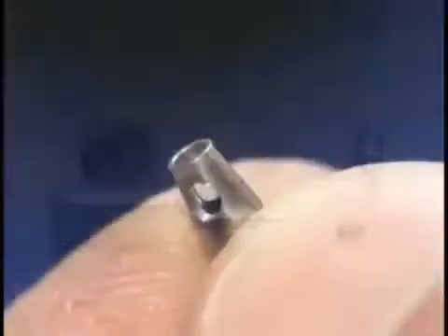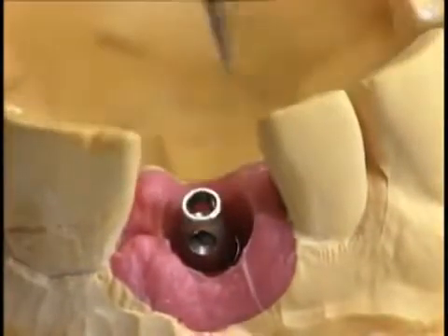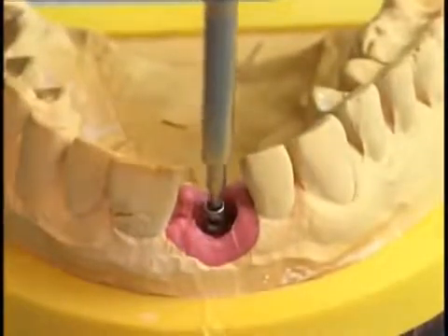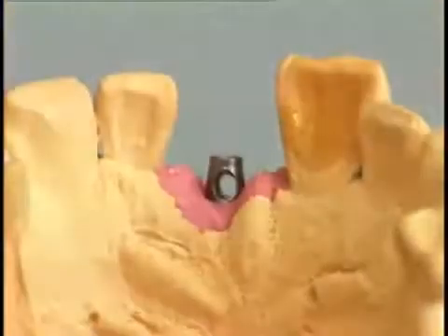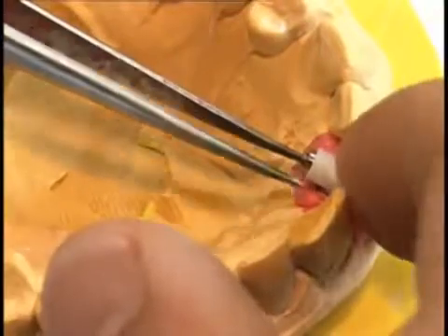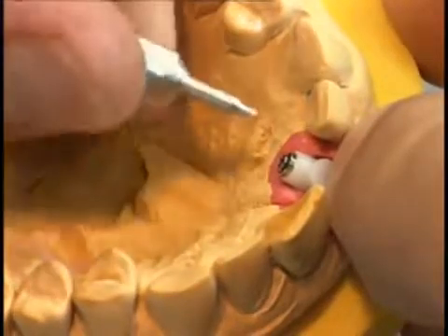The RN Synocta transversal abutment is placed on the RN Synocta analogue and aligned inside the octagon. The screw is manually tightened using the SCS screwdriver. A total of 16 different positions are available for the transversal opening. After positioning, the RN Synocta TS plastic coping is placed on the abutment and a transversal screw is used with a hexagonal TS screwdriver to loosely attach it.